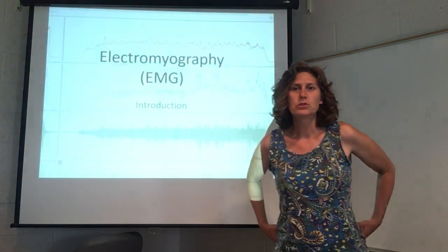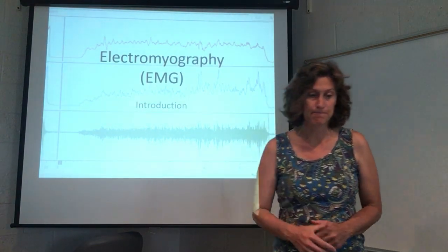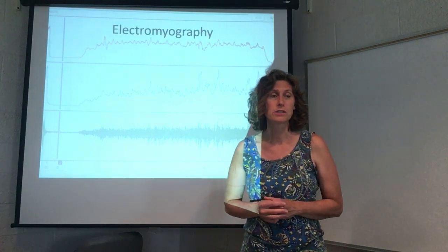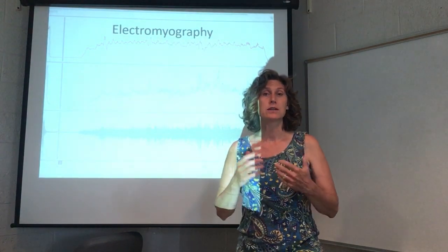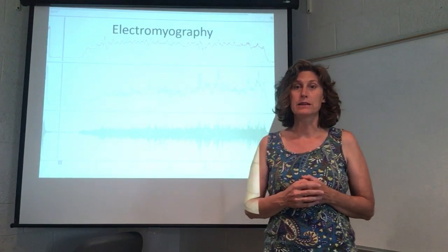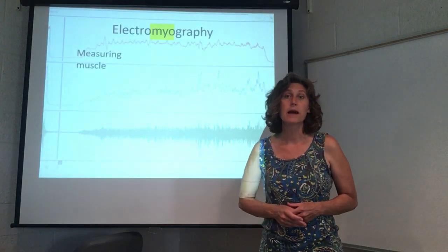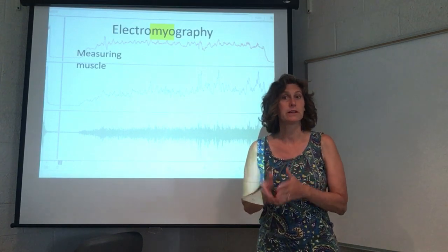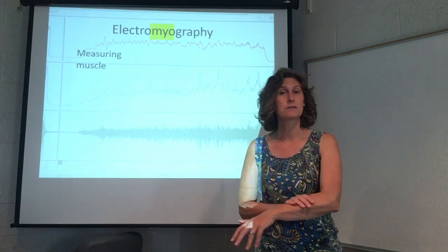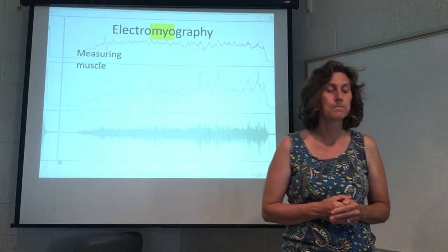Okay, welcome to the Introduction to Electromyography, also known as EMG. So again, we introduced, I think our first day of class, electromyography. It's one of the EGs, so it's measuring electricity in a graph, and the myo in the middle is standing for muscle. So in this lab, we'll be measuring muscle, specifically the electricity that is coming out of the muscle that can be measured at just the surface of the skin. So we're not actually putting probes deep into your muscle to measure that electricity.